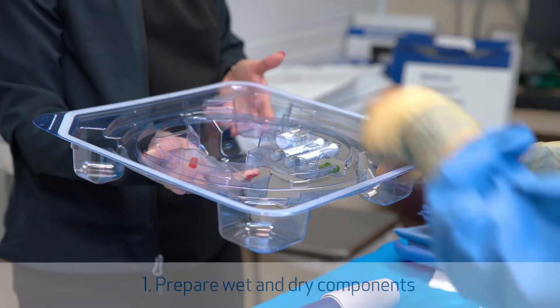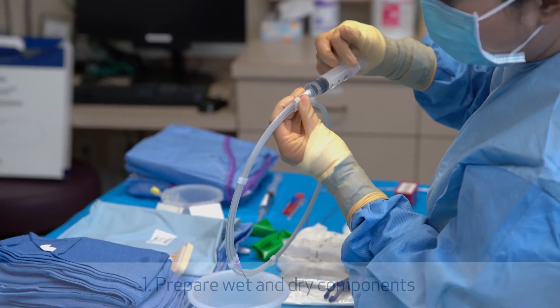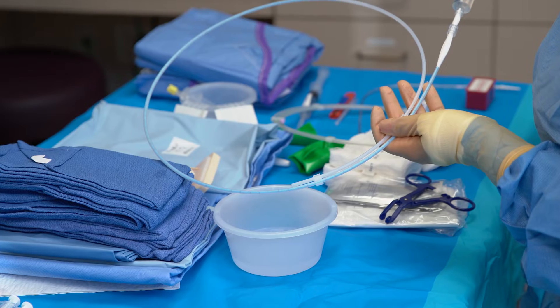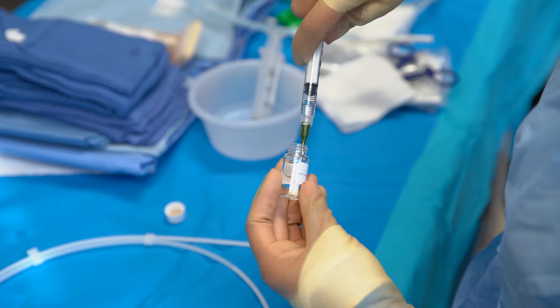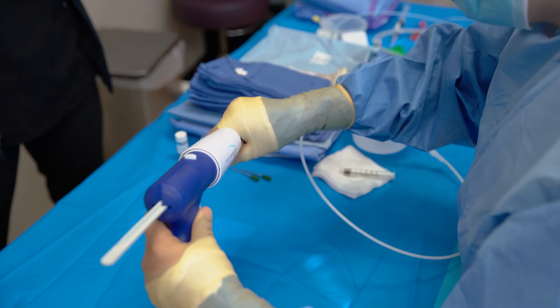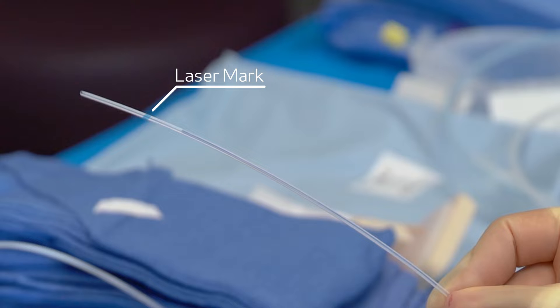We start by flushing the colored items — you'll see the green wire and the blue catheter. You want to separate your wet items from your dry items because the glue and the white glue catheter needs to be separate, as it will polymerize quickly. We attach it to the dispensing gun and then prime the glue catheter by depressing the trigger until it reaches the laser mark shown here.